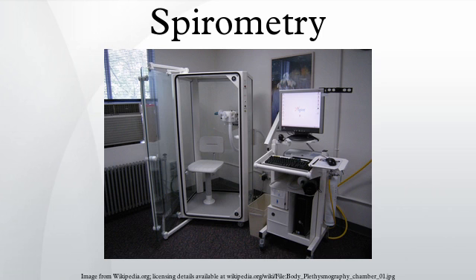Forced expiratory volume in 1 second. FEV1 is the volume of air that can forcibly be blown out in 1 second, after full inspiration. Average values for FEV1 in healthy people depend mainly on sex and age, according to the diagram at left. Values of between 80% and 120% of the average value are considered normal. Predicted normal values for FEV1 can be calculated online and depend on age, sex, height, mass and ethnicity as well as the research study that they are based on.